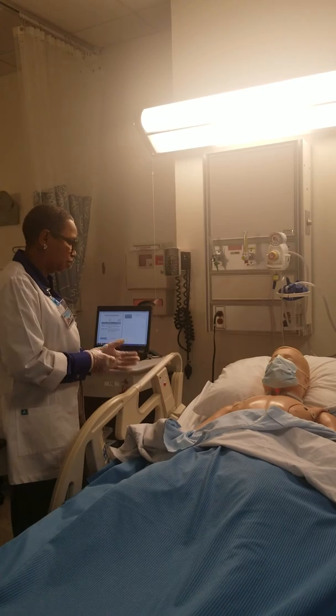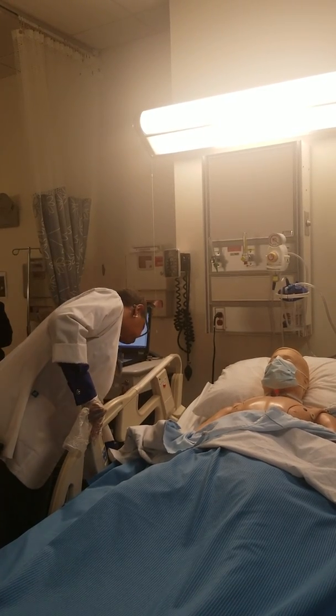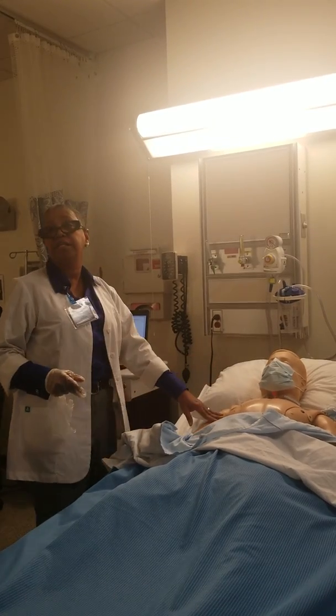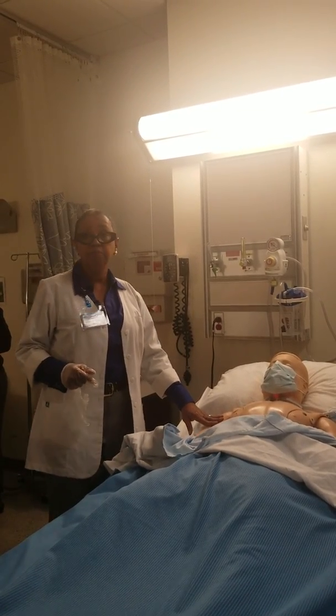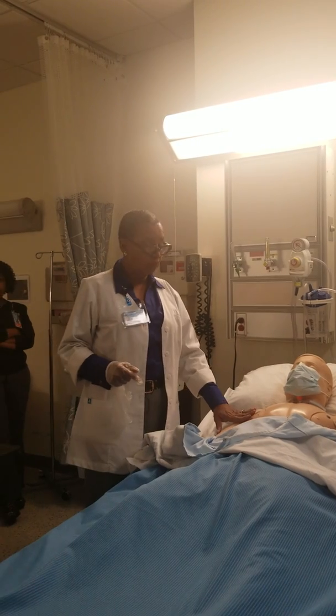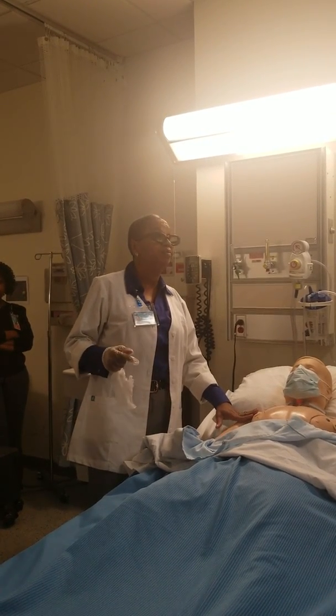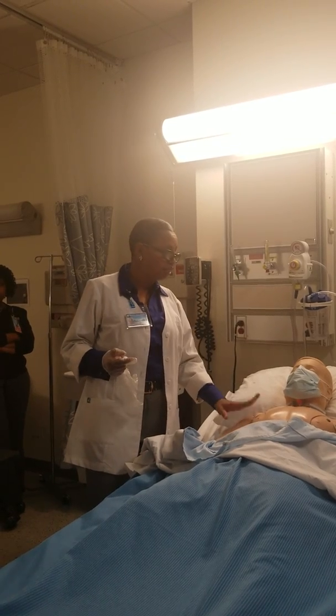So you come into your patient, perform hand hygiene. Tell them what you're going to do. What do you want to tell this person? Your dressing's been in for 7 days, I'm going to change it. You won't let them know there's anything particularly wrong, right? It's just something that we do per protocol. Okay, so I'm going to change your dressing.